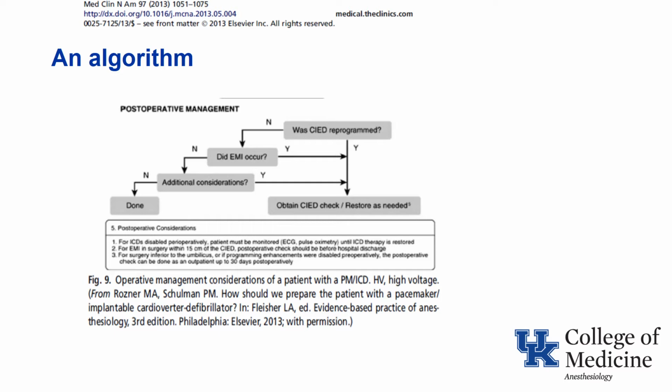Regarding postoperative management, if there were no reprogramming and there were no EMI and no other considerations, you're done. But if not, you have more work to do. One interesting item on this slide is the mention of infra-umbilical surgery, which allows for a delay in post-op programming or check on the device for up to 30 days.